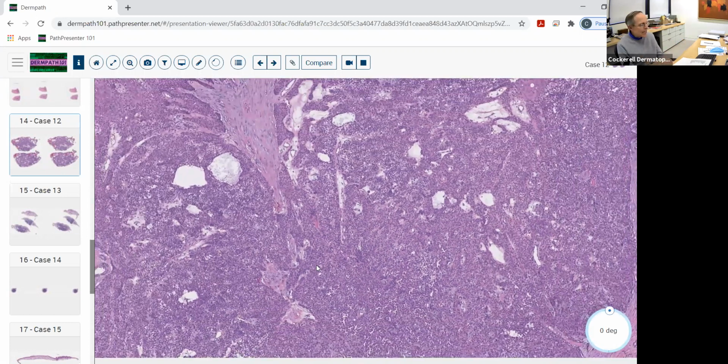One thing I didn't say that I'll mention again real quick is when you see a poroid lesion, I should have said this before, but we didn't have it on that example I showed you before, sometimes eccrine poroid lesions can give small zones of necrosis en masse. So normally when you think of large areas of necrosis en masse, we think of cancer. That's a sign of malignancy. But you get small areas, little geographic areas, not massive areas with mitoses and all that kind of stuff where it's really tumor necrosis or ischemia that's causing it.